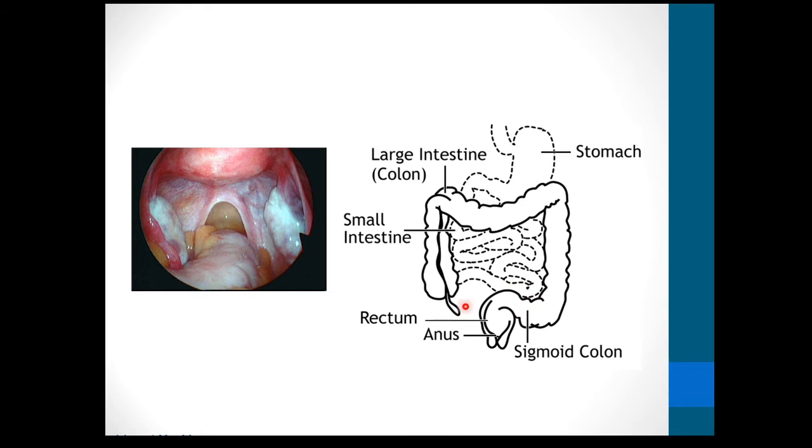Now, the majority of the lesions on the bowel will occur just where the bowel runs alongside those uterosacral ligaments, because what often happens is that there will be a lesion forming on the uterosacral ligament, and from there it may grow into the vagina, it may grow into the bowel, or it may make the ovary stuck to the uterosacral ligament. So this sort of area here is the main area where endometriosis will occur, and this level here is approximately 10 to 15 centimeters away from the anus.